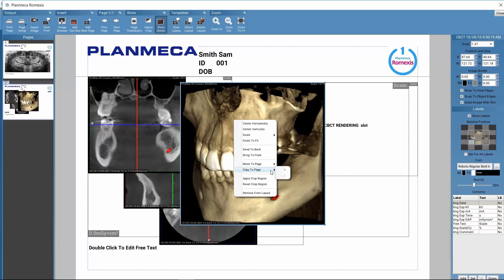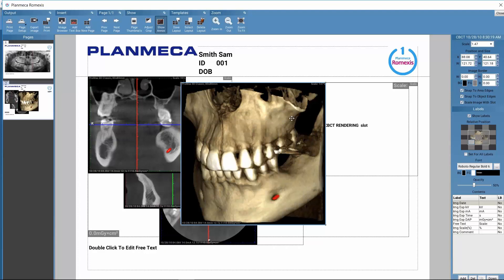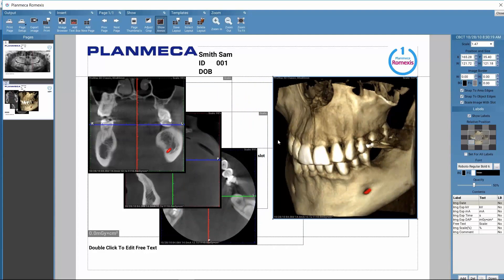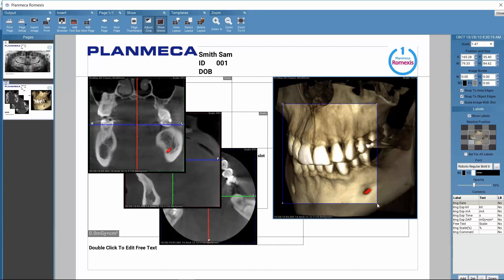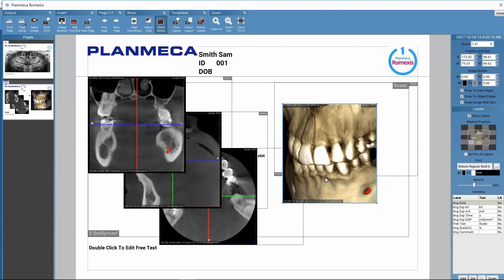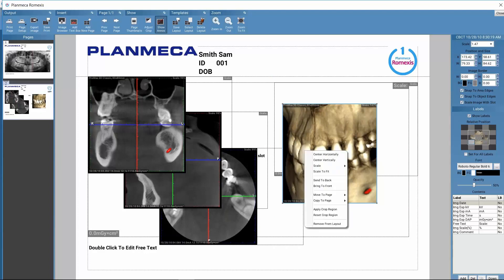Alternatively we might copy images so that we have the same image on several pages. If we only want part of an image included in the printout, we can determine cropping. By activating the 'Adjust Crop' button in the upper toolbar, we can drag with the mouse to define which area of the image is included. Then we right-click and select 'Apply Crop Region'. We get the cropped image and we can also reset the crop through the right-click options.